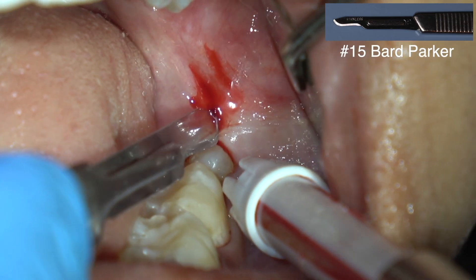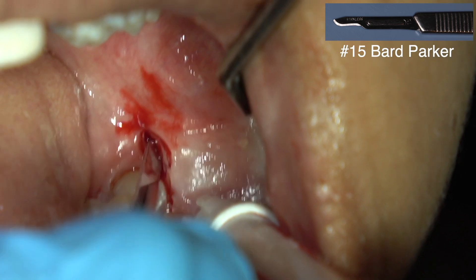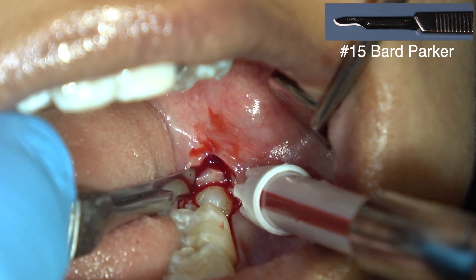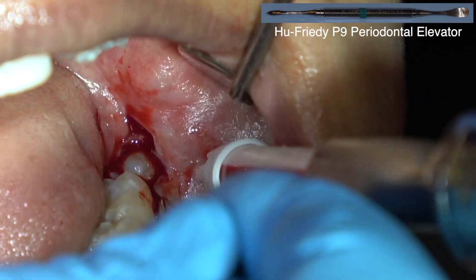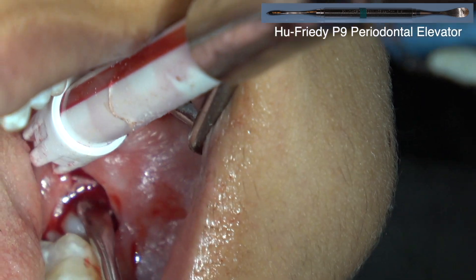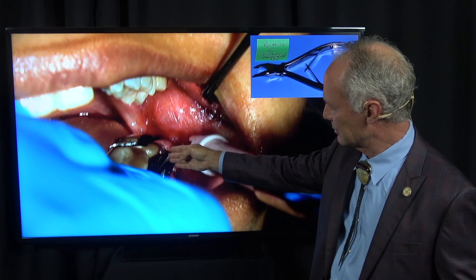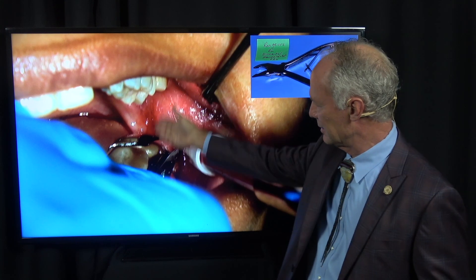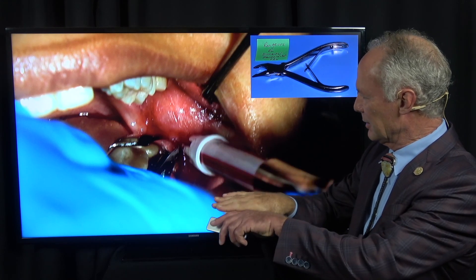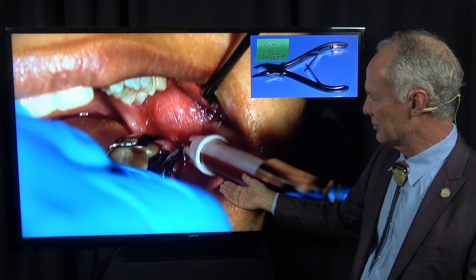Here's the intraligamental. You can see the wisdom tooth back here. I'm making an incision up the ramus of the mandible on the facial side of the tooth, sliding right into the sulcus on the facial side. I'm creating a distal wedge back here — don't cut way onto the lingual. You don't have to worry about the lingual nerve if you keep it within the confines of the tooth. The distal wedge makes suturing the flaps more effective — the flap will come together nicely when you remove the most distal tooth in the arch.